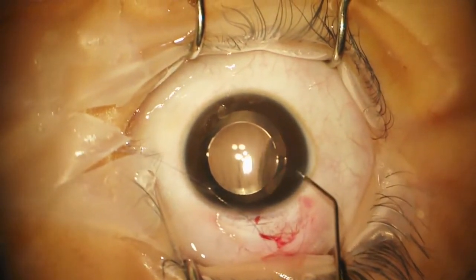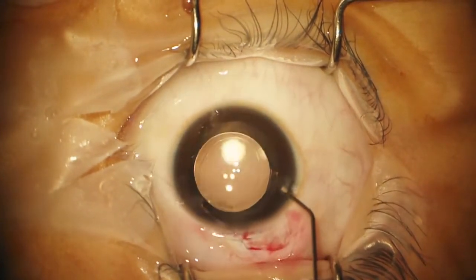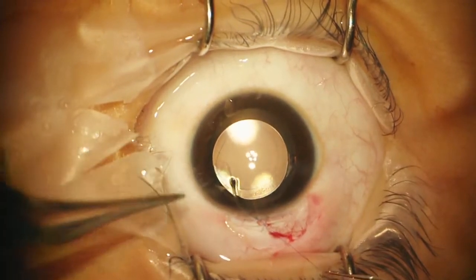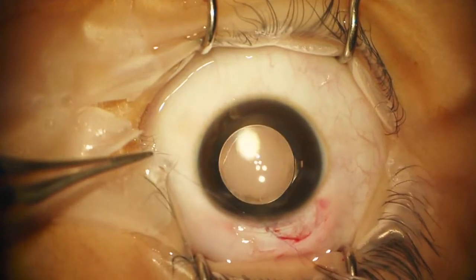We'll take BSS in a syringe to hydrate the incisions. Fortunately we didn't have to use the pars plana entry, so there's not much there — mainly we'll use it to fill. The question was: when should the other eye be done? I think ideally the next eye should be done at about a week.